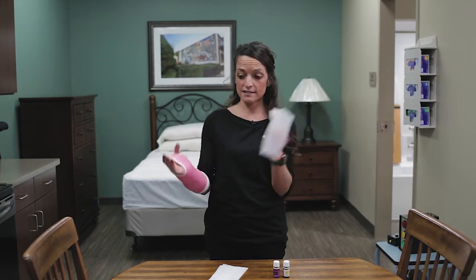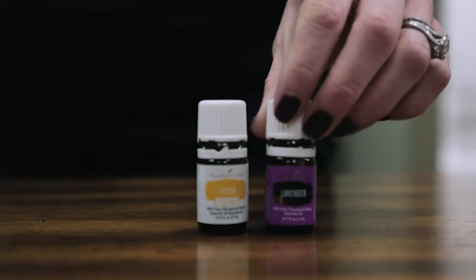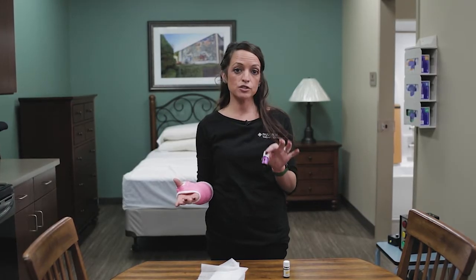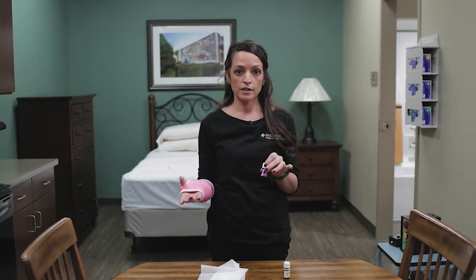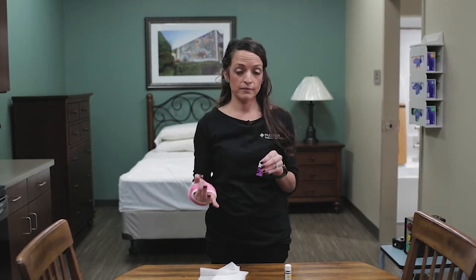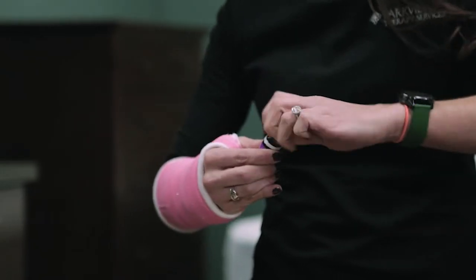A couple of hacks to control odor involve simple things you have around the house. Take some dryer sheets and rub them on the outside of the cast. You can also make a simple solution of essential oils — about two drops of essential oil to about a tablespoon of alcohol. The alcohol is important; don't mix it with water.